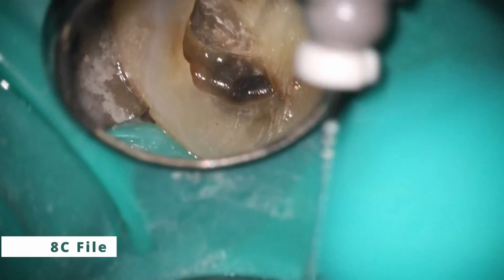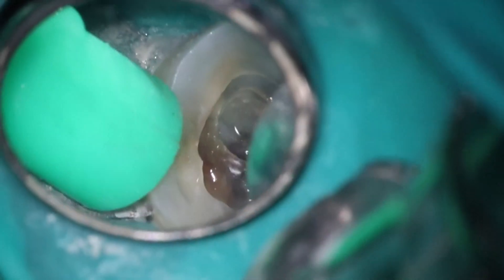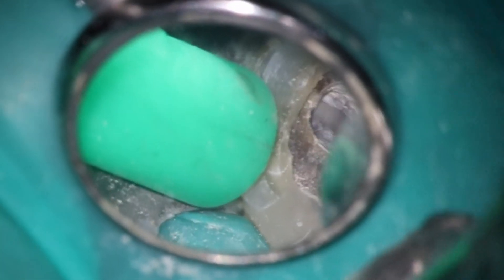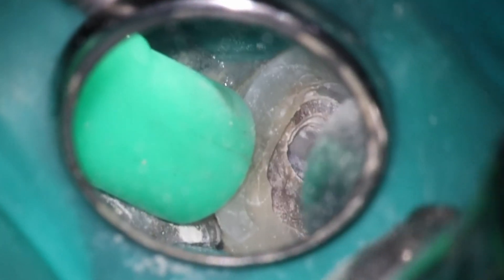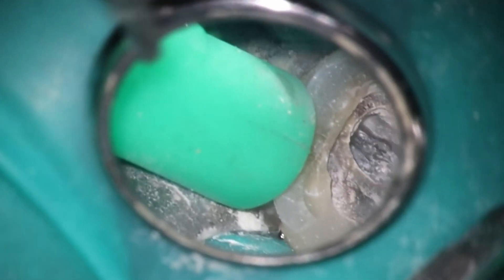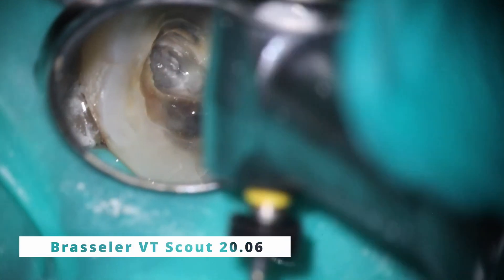I dropped down and started to see a little bit of spots but couldn't get anything with the 8c, so we're going to go back in with that workhorse. This time without water — just gentle brushstrokes. I like finding the mesials first; a lot of people go for the palatal but I tend to go after the mesials. Having suction and air with the assistant really blows out all the dust so it's much easier to see. I've already found a couple of spots that look like they're going to be the MB and MB2. I'm starting to work towards the palatal, which was pretty wide open — not a surprise. There's our MB2, there's our MB1, and I did pick up the distal. With those four being found, I can start the process.